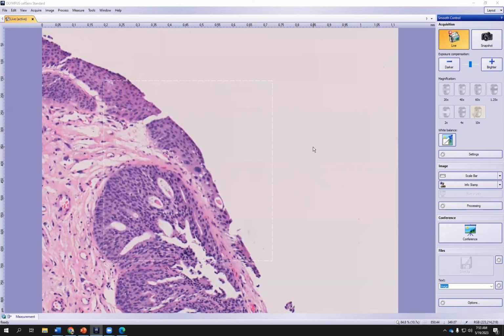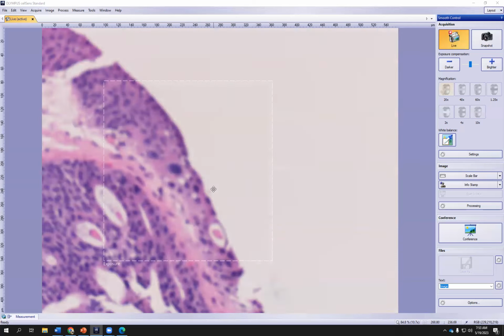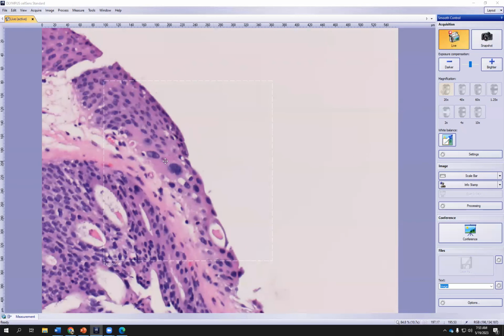So how do I tell confidently that this is an umbrella cell and not an atypical cell that is representative of carcinoma in situ? So there are a few clues. One is you have to first identify that it might be a tangential section here. The other is the umbrella cells often have some squamoid features. So you can see, sometimes you can see the cell borders of these cells. So you can see a nice polygonal shape that you often see in squamous epithelium. Okay, that's one.